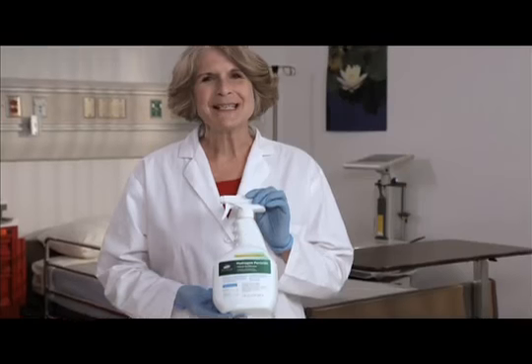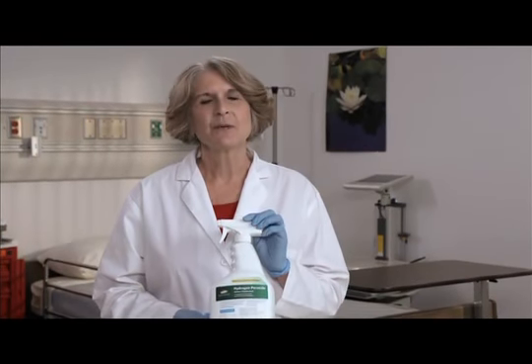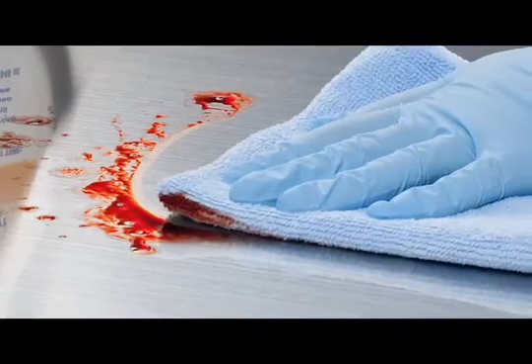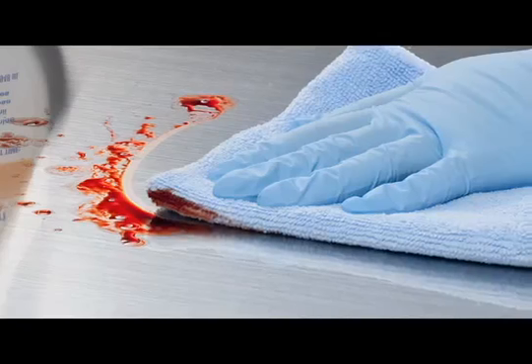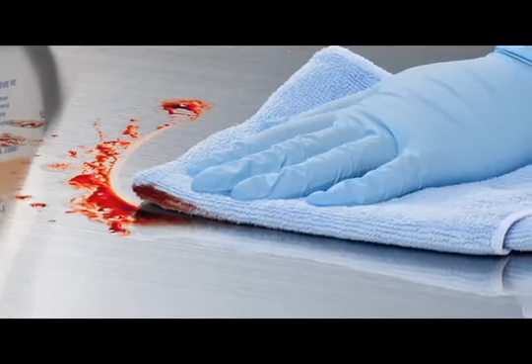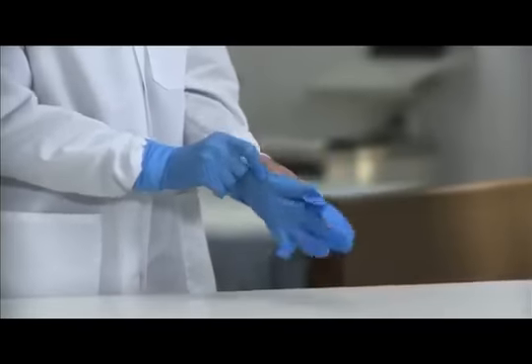I will demonstrate one-step cleaning and disinfecting using Clorox Healthcare Hydrogen Peroxide Spray. If handling items soiled with blood or body fluids, don additional personal protective equipment as specified by your hospital protocol. I have already washed my hands with soap and water and am wearing gloves.